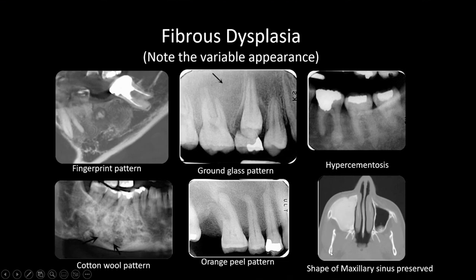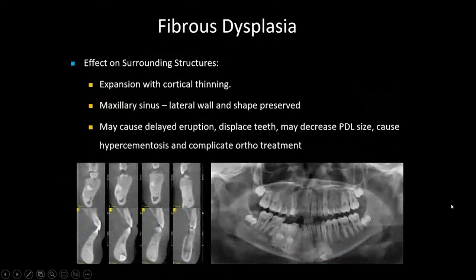Fibrous dysplasia expands into the sinuses but maintains the shape of the sinus with intact cortical borders. Teeth associated with fibrous dysplasia often have hypercementosis. Other signs include expansion of the mandible with ground glass appearance, thinned but intact cortical borders, displaced teeth, decreased periodontal ligament size, and complications for orthodontic treatment. The mandibular canal may be superiorly displaced — one of the only conditions that does this, as most displace it inferiorly — a hallmark feature.